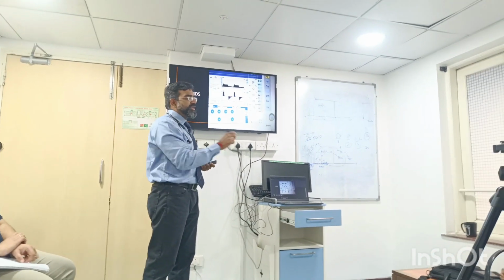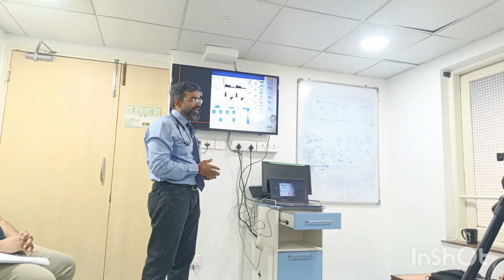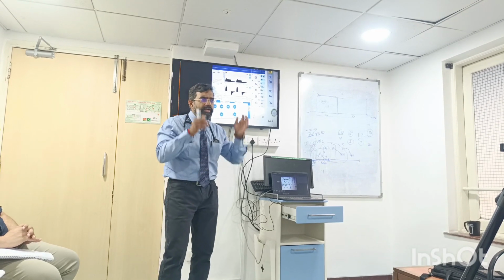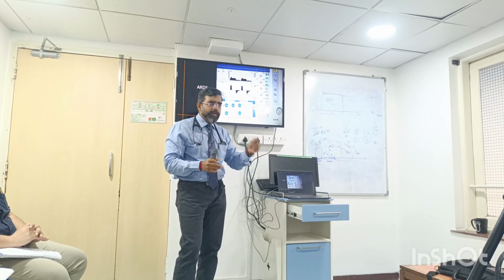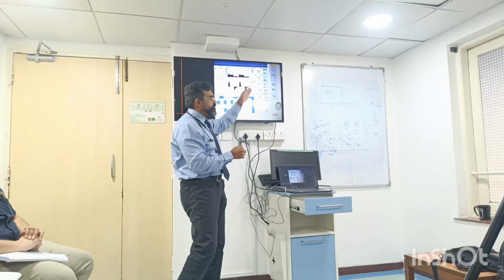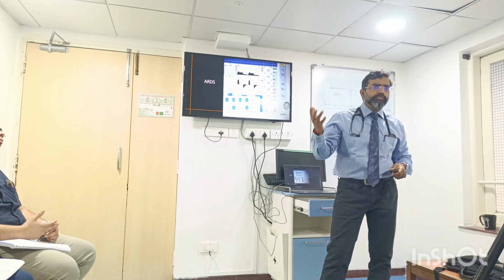So if a person has just set the ventilator and gone, it doesn't make any sense. If you set the ventilator, it means you're standing with the ventilator. This is the time, especially after intubation, where you are getting to completely understand the lung, because you have just paralyzed your patient. In that paralysis, you have done plateau pressures, compliance, resistance of airways, driving pressures, and you're seeing the rest of the machine parameters. You understand? So the time you ventilate your patient, you don't pat your back after putting a tube through the airway. You just started your work actually.